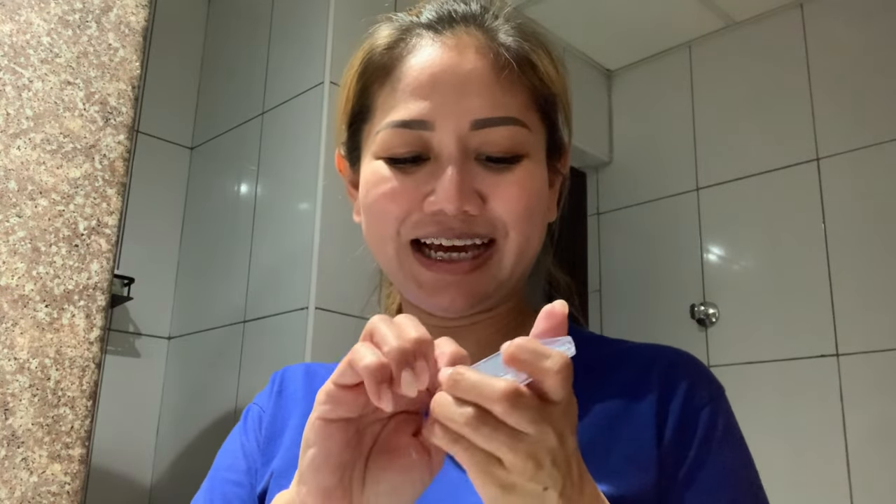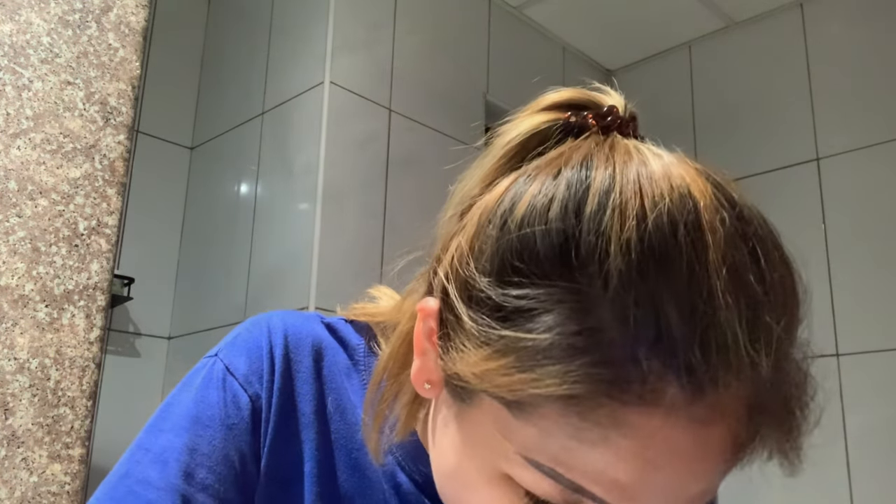My daughter saw me putting wax around my teeth individually, which is very time-consuming. She suggested this lip protector as a solution. The case is a bit hard to open — it's also sealed inside with another plastic wrap.